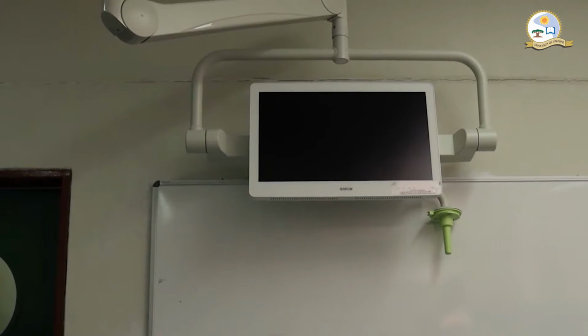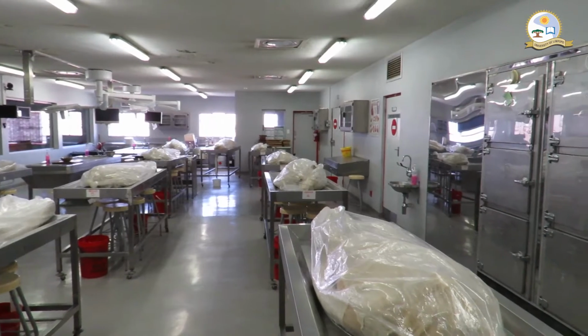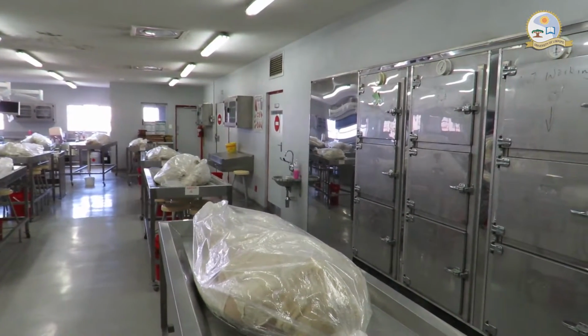Operating, the student can see what is safe. Let's say they are operating on a small part, they can see that it will be magnified on that monitor.